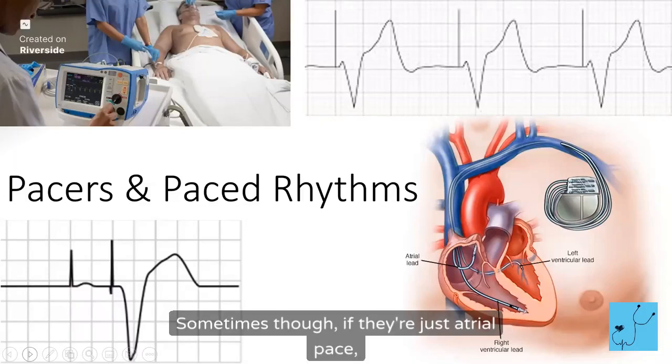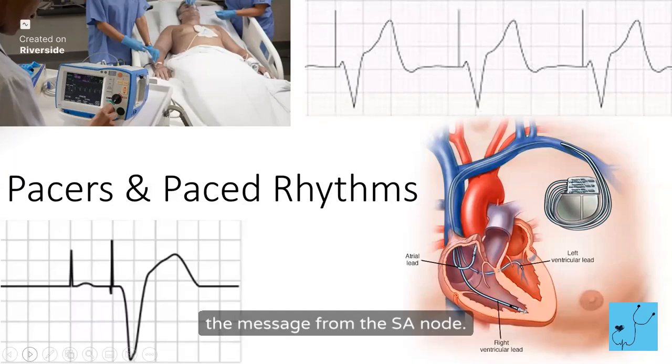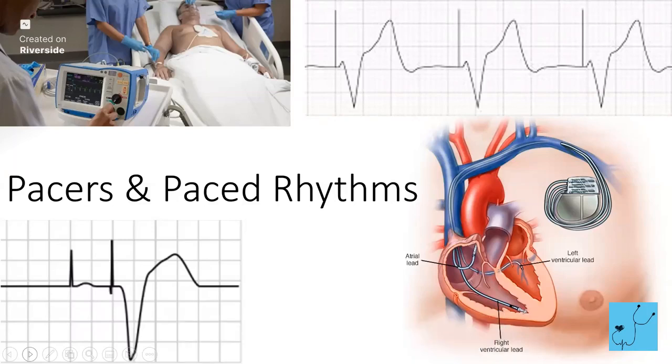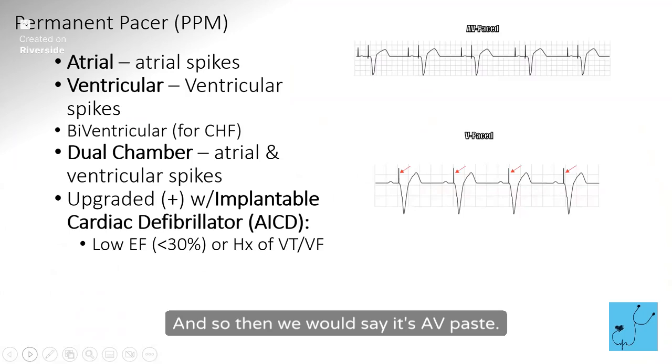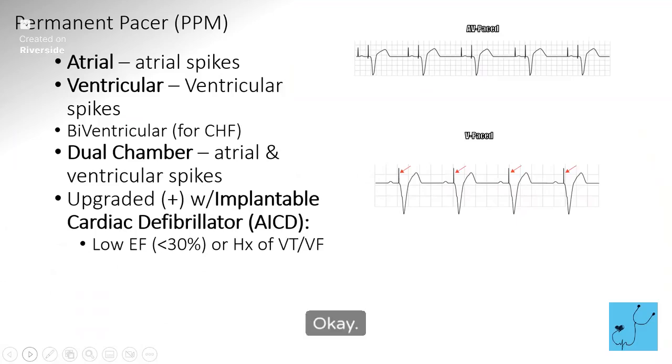Sometimes though, if they're just atrial paced, and all we're doing is kickstarting the SA node, then the ventricle is actually getting the message from the SA node, and it will be narrow. But if you have a spike for the ventricles also, it should be wide. Then we would say it's AV paced, we have both. Or it's V paced, just ventricular paced, because their atria does its own thing, but the ventricle doesn't listen.